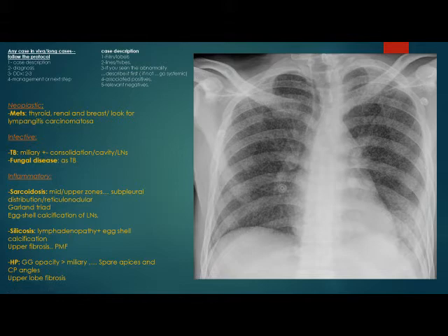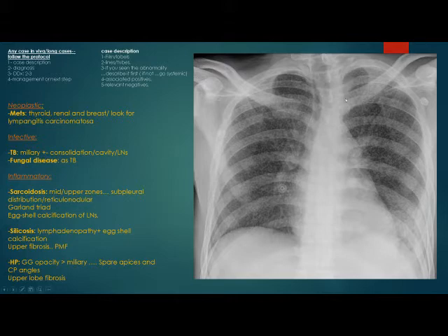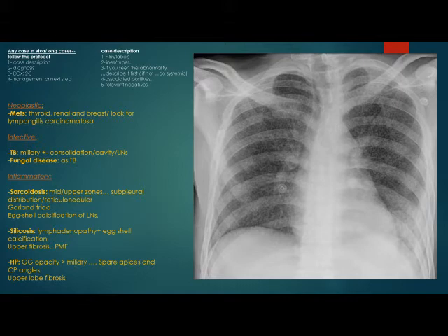In conclusion, this is a case of bilateral nodular pattern with a wide range of differential diagnoses. It can be infective like tuberculosis, or neoplastic — especially metastasis. It can also be other inflammatory diseases like silicosis, hypersensitivity pneumonitis, or sarcoidosis.